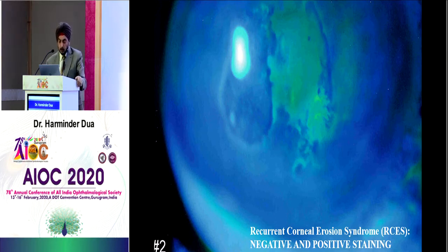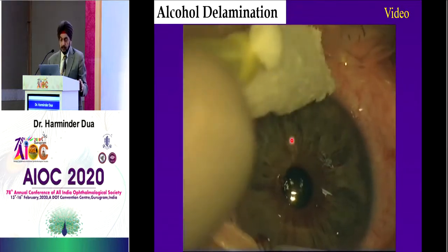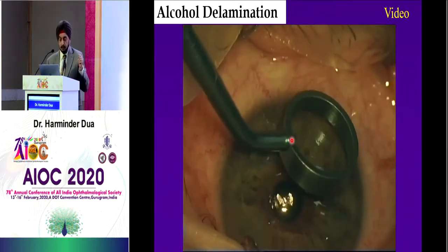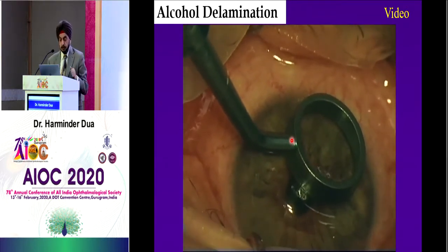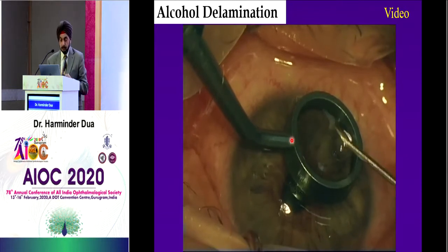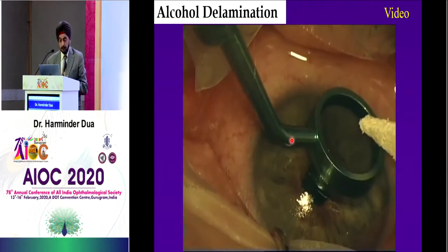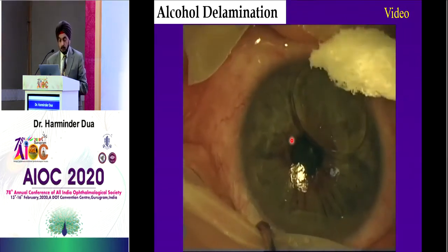This is the negative staining, and that's the whole area that you have to treat. This is a little video showing how you dry the eye, put your zone marker, then apply a little bit of pressure on the cornea — not a lot, just a little. Then you put your 20% alcohol in, which you have prepared, and then you wait for 30 seconds.